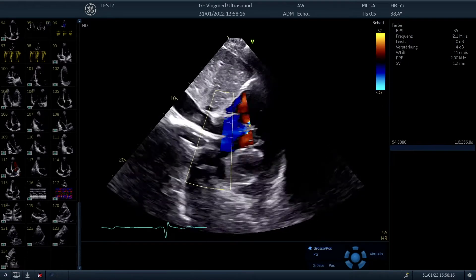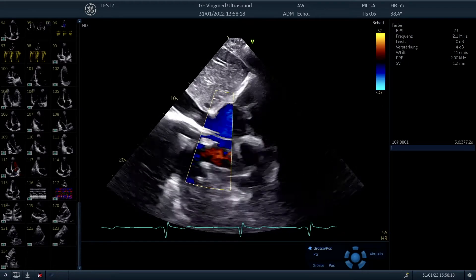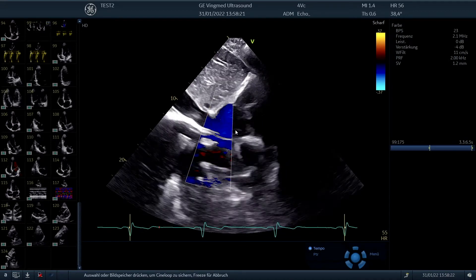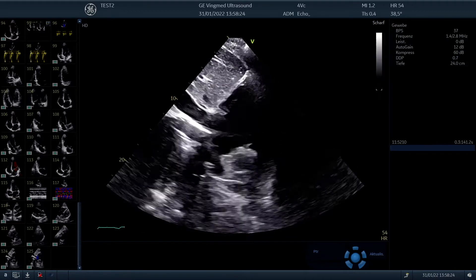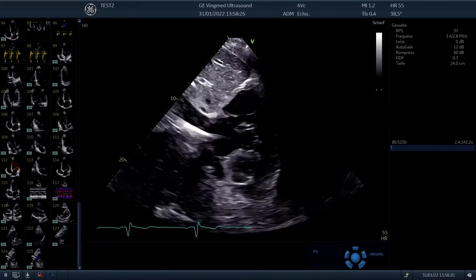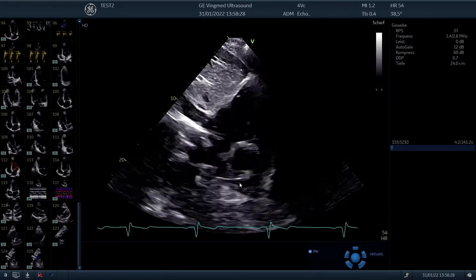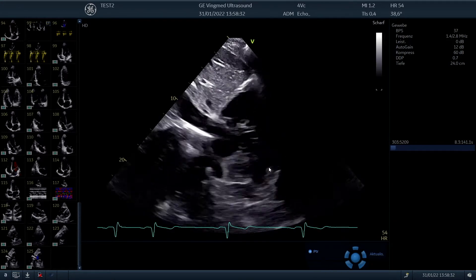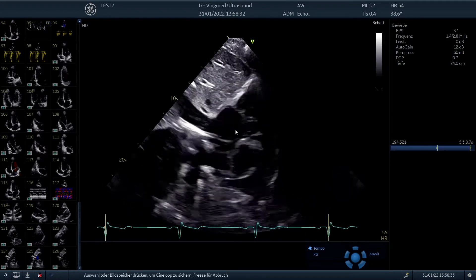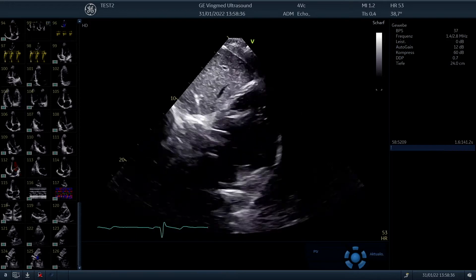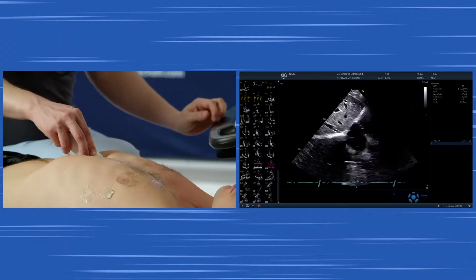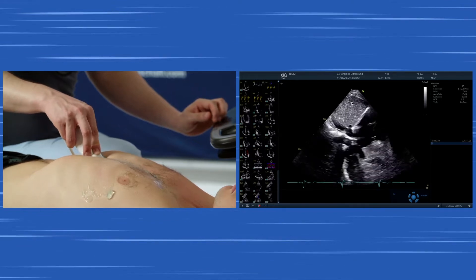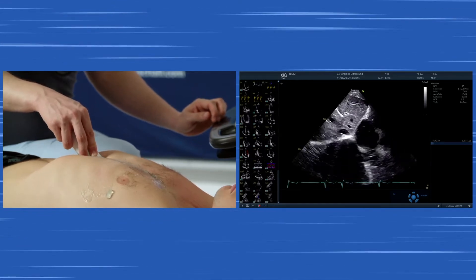If we use color Doppler here, we can visualize the IVC as well as parts of the SVC — the superior vena cava and the inferior vena cava. We can also display the pulmonic trunk here, which gives us a nice view of the pulmonic trunk. As you may recall from the compact echo course, these views can also be displayed from a subcostal approach. If we rotate the transducer more towards the head, we can see the IVC and its entry into the right atrium.